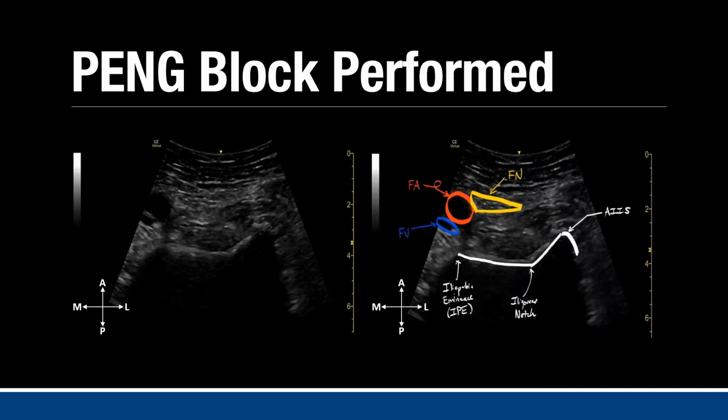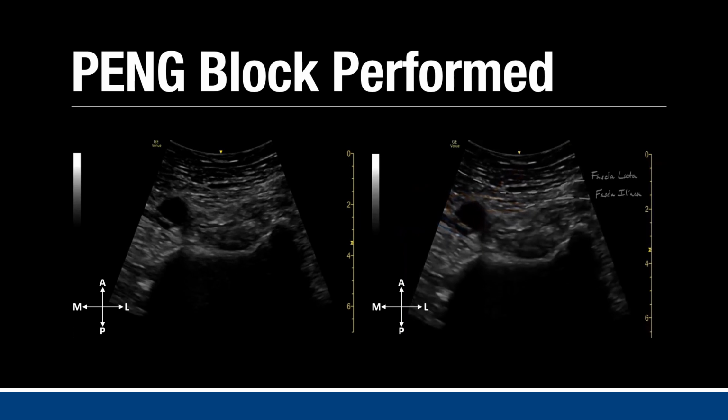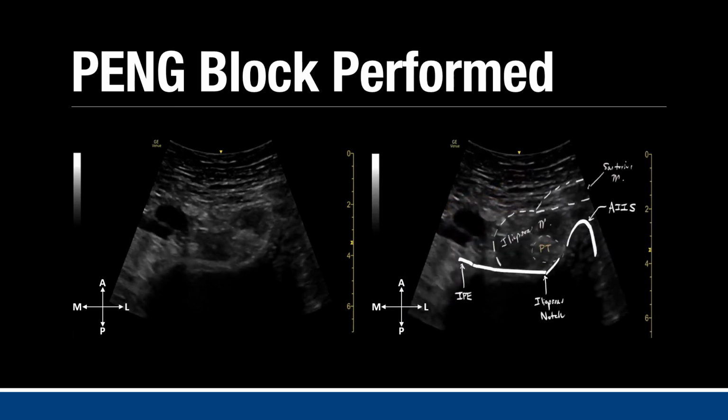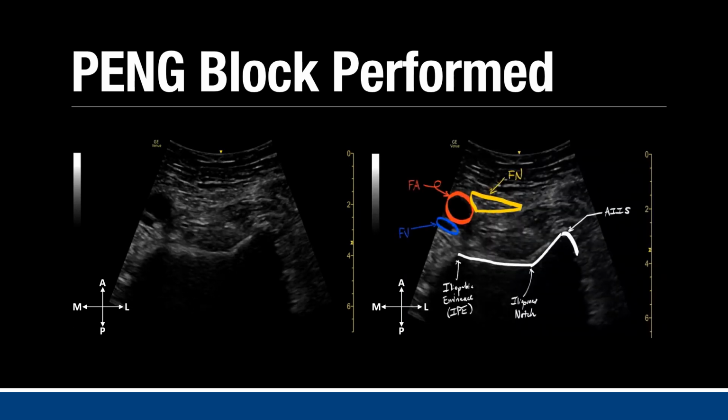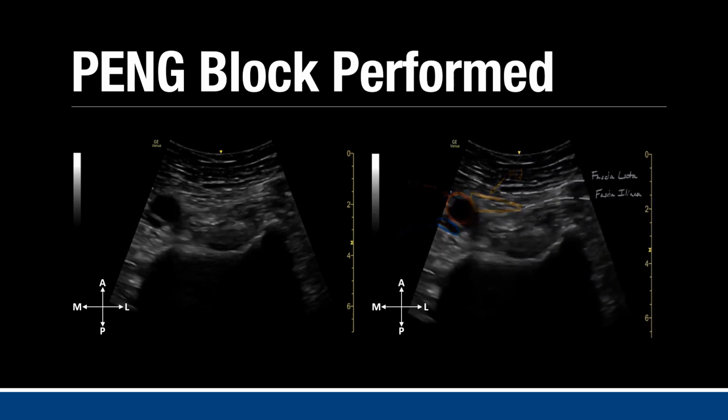The last couple slides of this presentation depict an actual PENG block performed in our emergency department for an elderly woman who suffered a ground level fall with a left transverse femoral neck fracture. A curvilinear probe was used to perform this block due to the patient's body habitus.